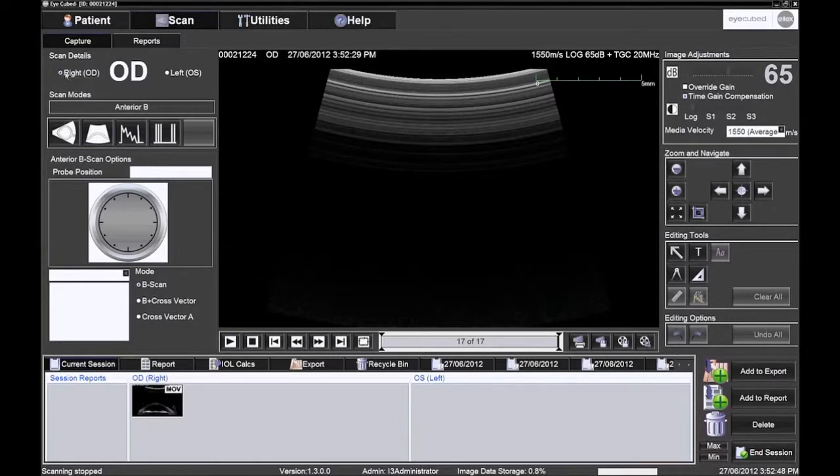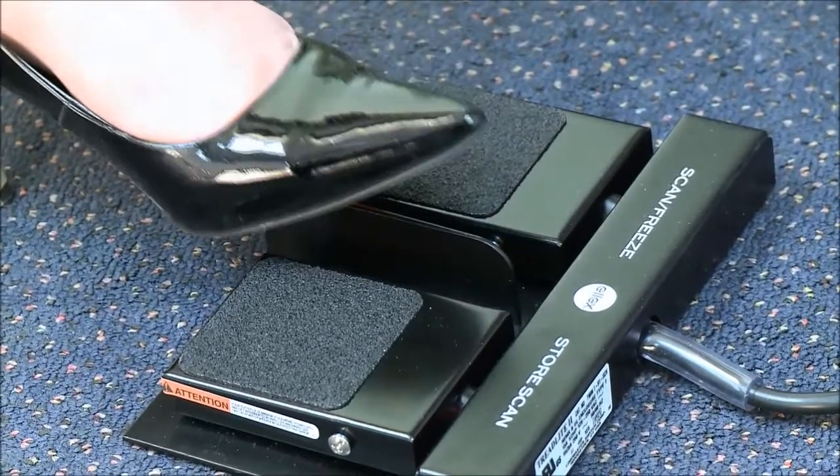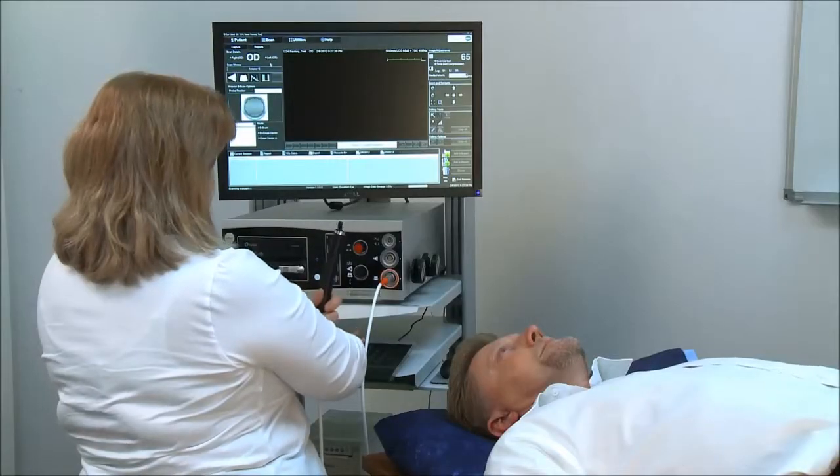Choose the eye to be examined by clicking on OS for the left eye or on OD for the right eye. Choose the scan mode, anterior B scan, by clicking on the second pictogram. Press the foot switch, or F11, and the probe starts to scan.